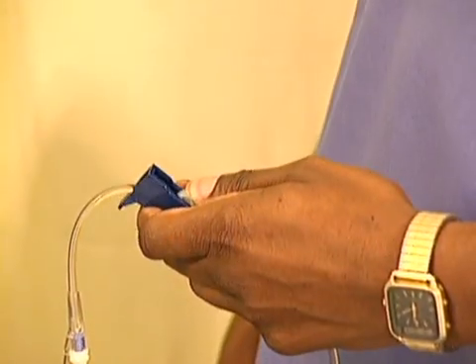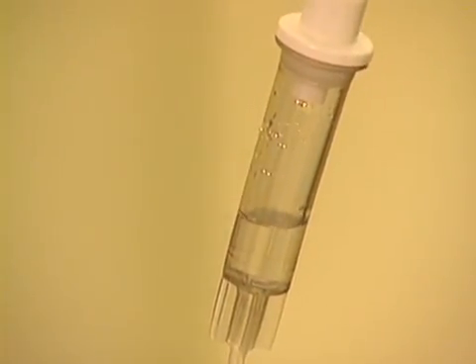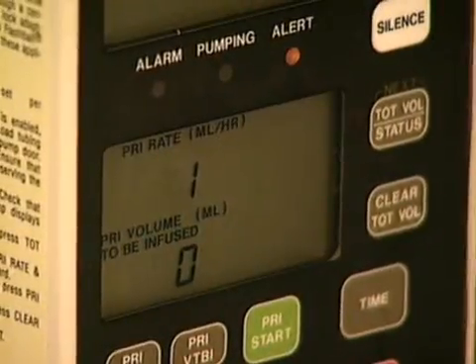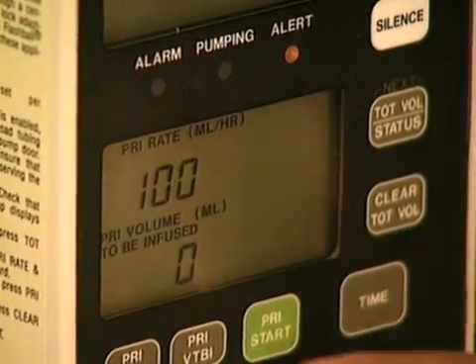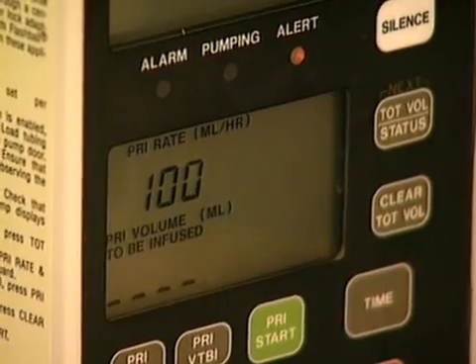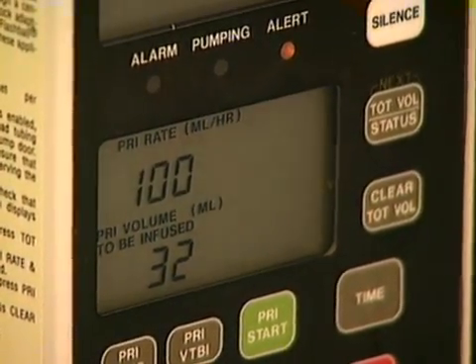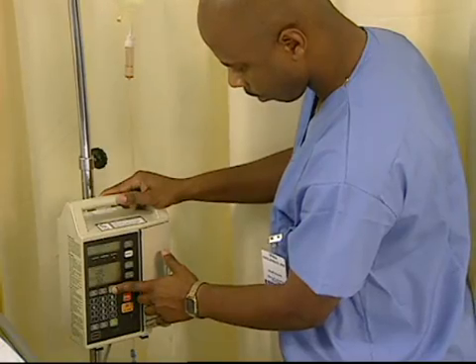Be sure the drip regulator on the tubing is open completely to allow the pump to regulate the flow. Set the infusion pump to deliver either the prescribed volume of fluid over the correct period of time or the calculated drip rate. Use a watch to check the drip rate.